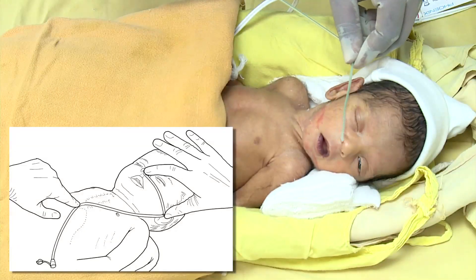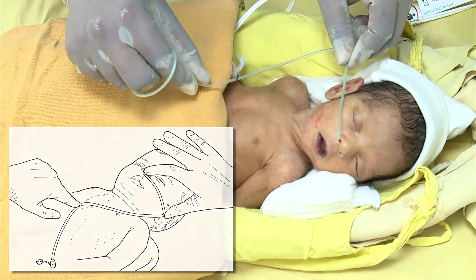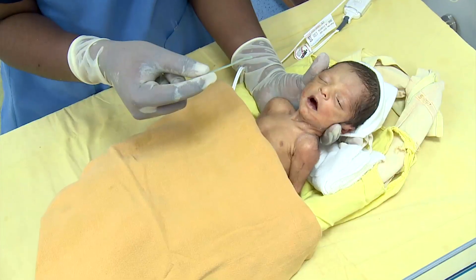Measure the tube from the bridge of the nose to the tip of the earlobe and then to the tip of the xiphoid. Mark the tube with tape indicating the length of the feeding tube to be inserted.